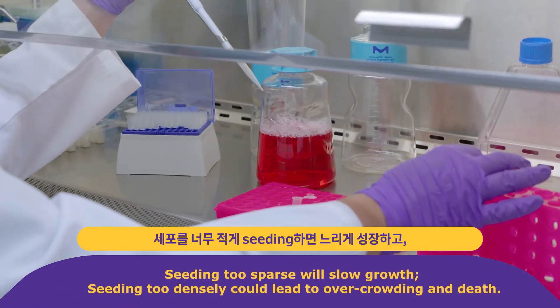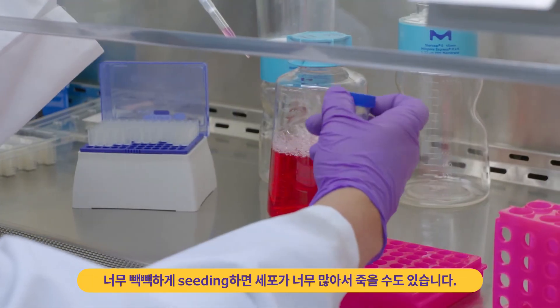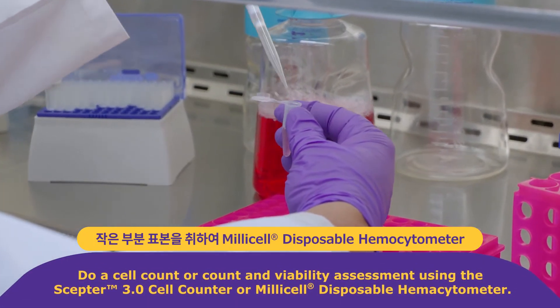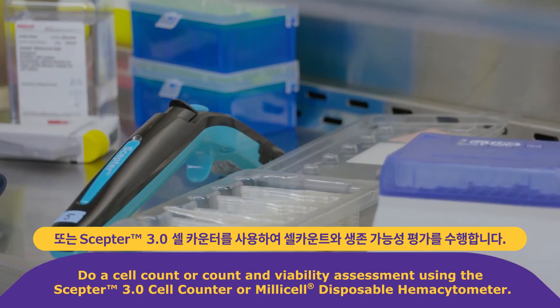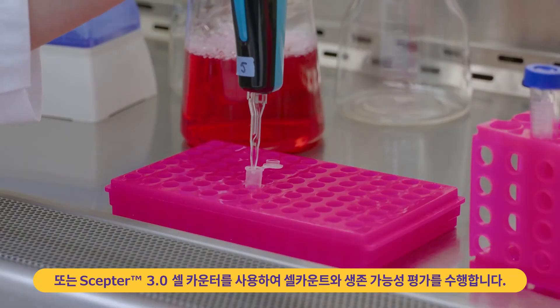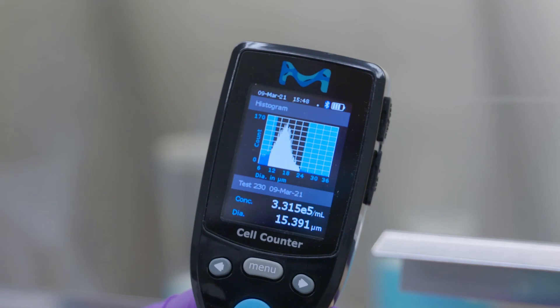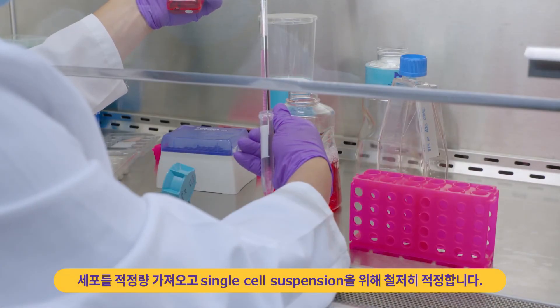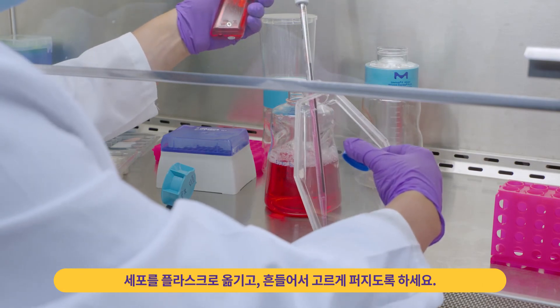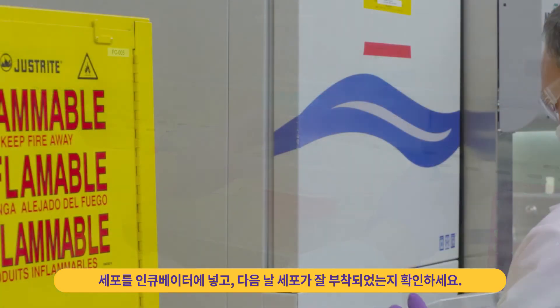Seeding too sparse will slow growth; seeding too densely could lead to overcrowding and death. Take a small aliquot to do a cell count or count and viability assessment using a Scepter cell counter or Millicell disposable hemocytometer respectively. Bring cells to their proper volume and triturate thoroughly for single cell suspension. Transfer cells to the flask and rock to ensure even spread.